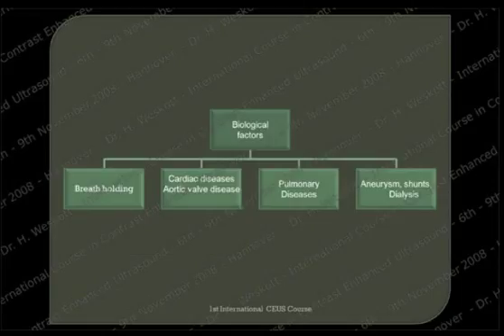Biological factors are important. If you have tiny lesions in the liver, you very often will ask the patients, please take a deep breath and hold it. If you start with this maneuver before you inject the contrast agent, then the kinetics will change. Because when you look at the patients, the veins in the neck will pump up. This is the same that happens in the liver. So the contrast agent will arrive a bit later. And when the patient exhales, then you will have a large inflow of contrast. You have to have that in mind.